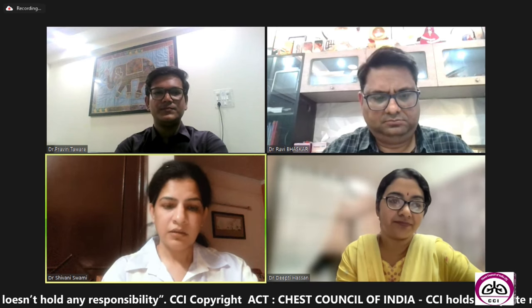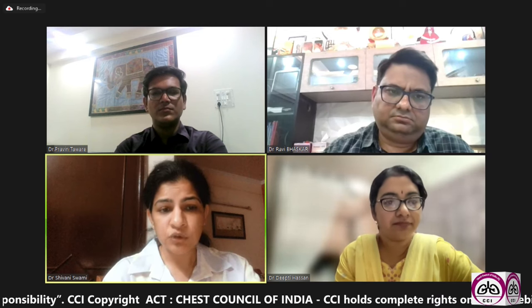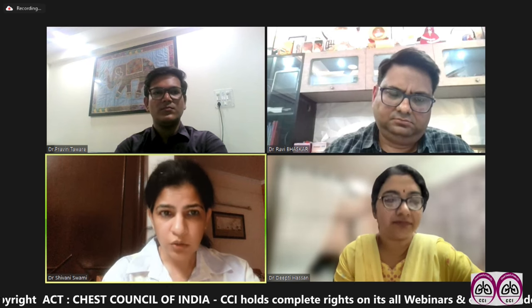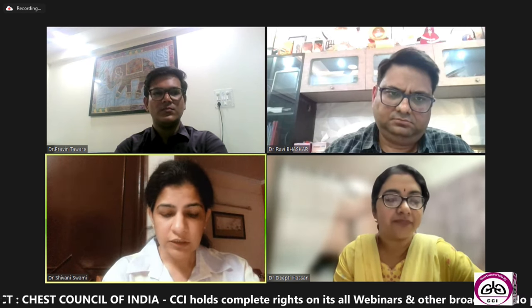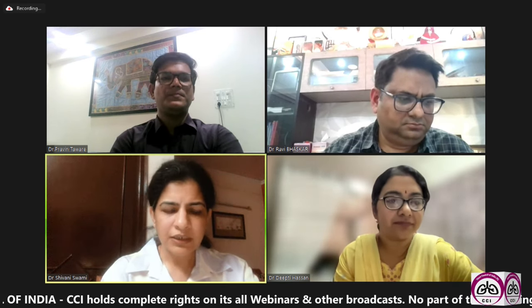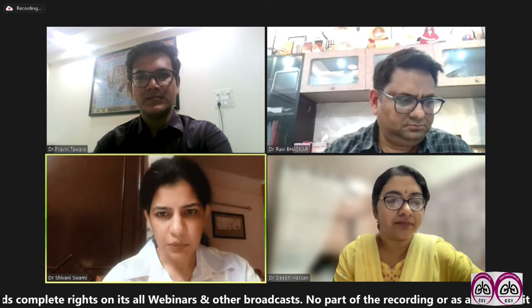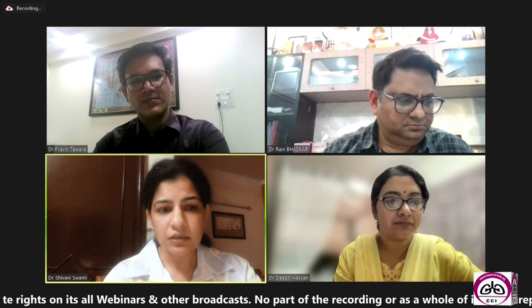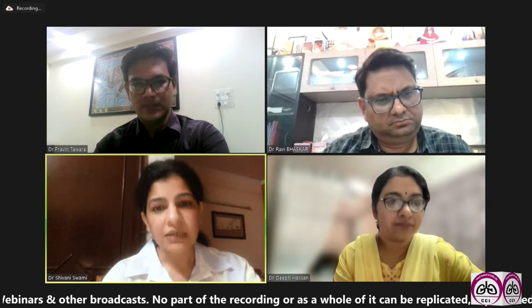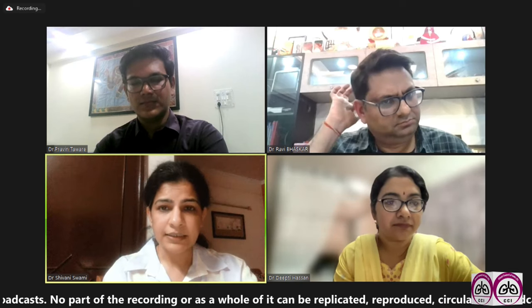Yeah, sure. I would just like to add that a breath actuated inhaler today is actually even cheaper than an MDI with spacer. So I think it is quite cost effective. And since you're talking about DPIs as well, I would also like to add that there is now a device available in the market wherein you can deliver two DPI drugs at the same time with the same inhaler. I'm stating this only to cover all bases.